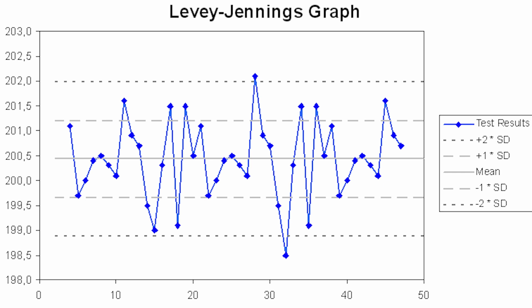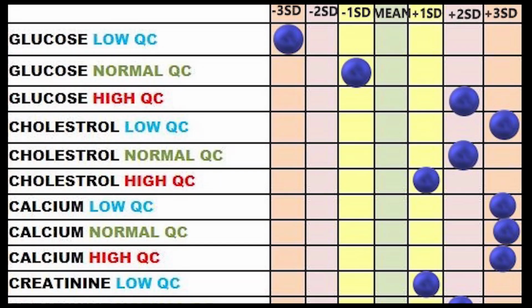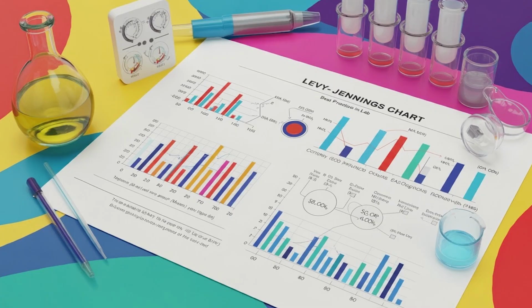We will move on to the next step, instrument condition. Check other sample test results and other tests. If we are getting all low or high results for all tests, it indicates there is something wrong with the instrument. If there is an issue, stop the instrument, fix the instrument issue, and run the QC. If the QC results are within acceptable range, run the test.